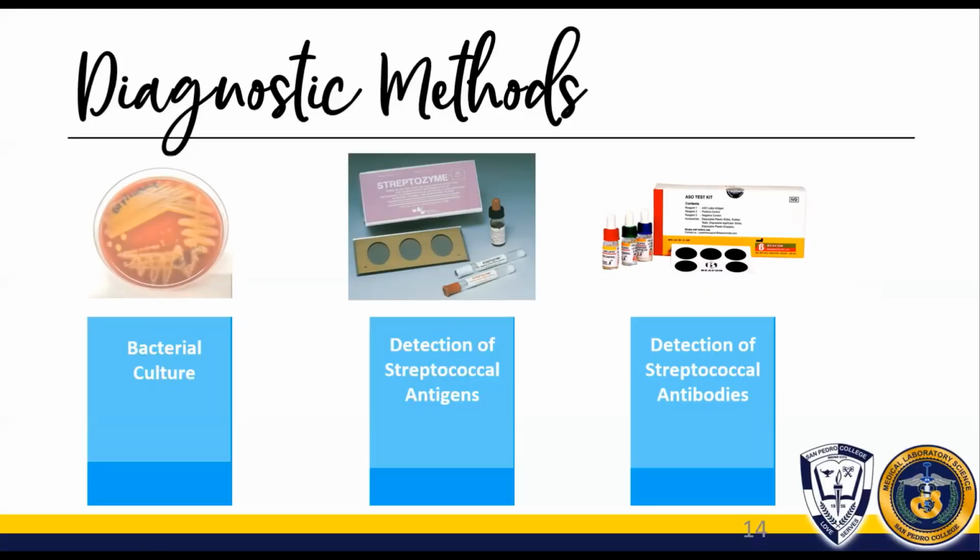Now, why should the doctor request for detection of antibodies? Bakit antibodies? Yes, exactly. Kasi class, there is no longer active infection. The causative agent may no longer be present. No? Tapos na kasi ang infection eh. So, wala na ang organism, wala na ang bacteria. So, wala na tayong ma-isolate na bacteria. And probably, wala na ring antigen kasi na-clear off na ng ating body.